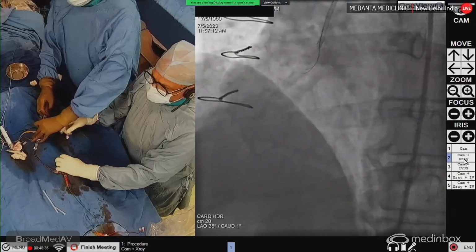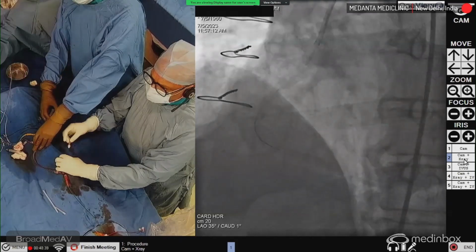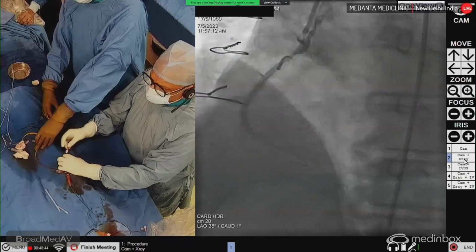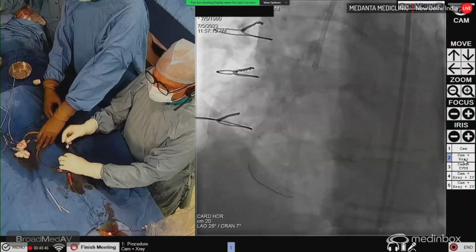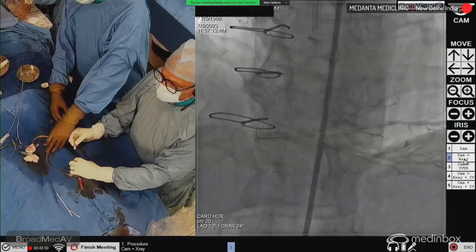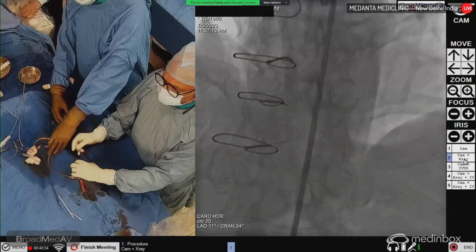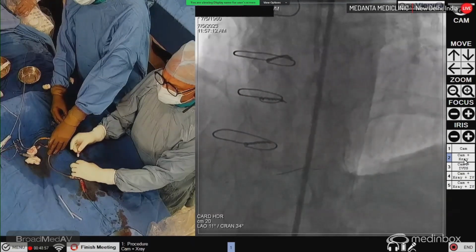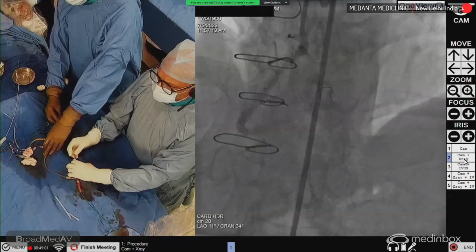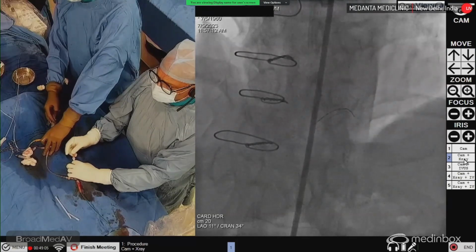Check, please. Yeah, so up till now, the wire movement is fine. Okay. Yes.